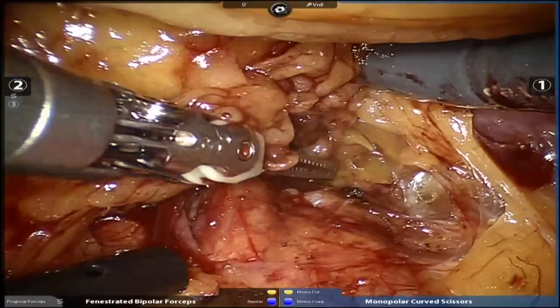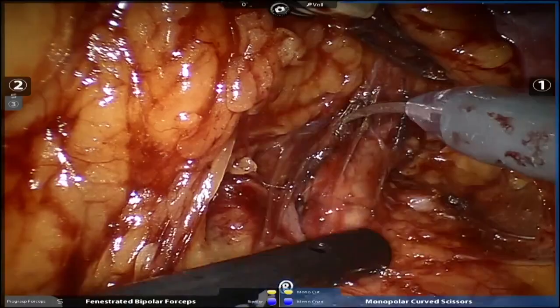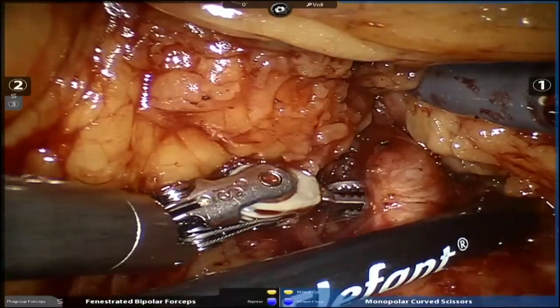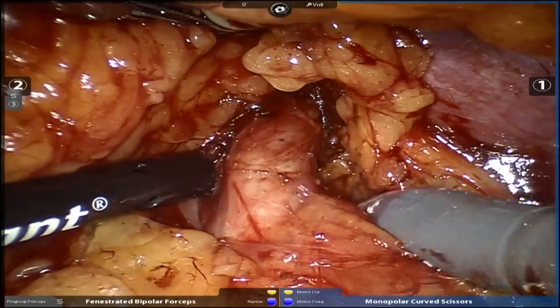All right. And then the other question is the vein. What is your concept for this surgery today? Do you go to clamp the artery, or do you go for segmental arteries? Right. So this is a big tumor. I think a segmental approach is possible, but it may not be probable because this is a very large tumor. This tumor is probably getting contributions from both the anterior and posterior branch of the renal artery.